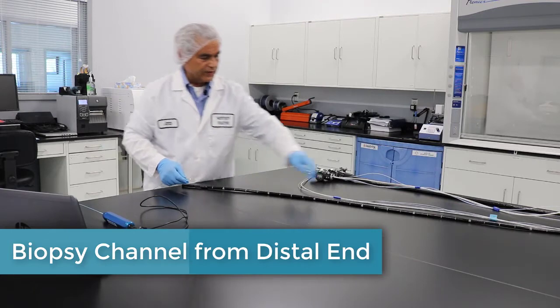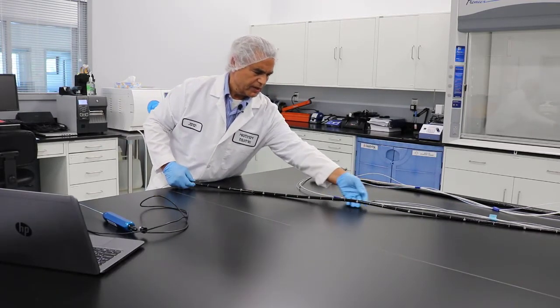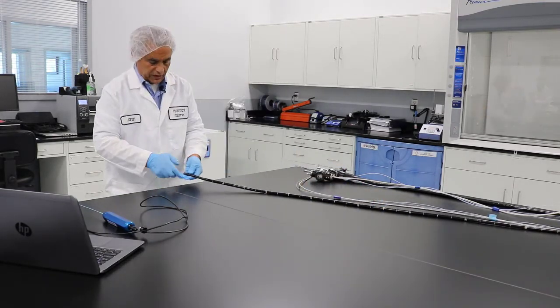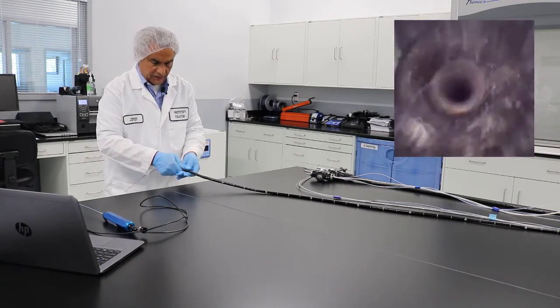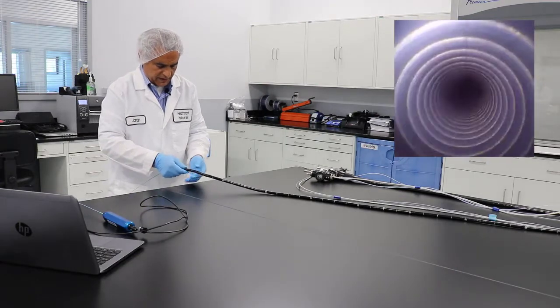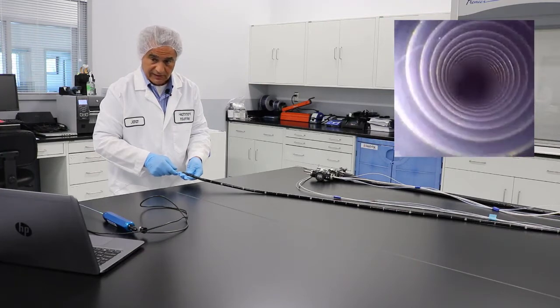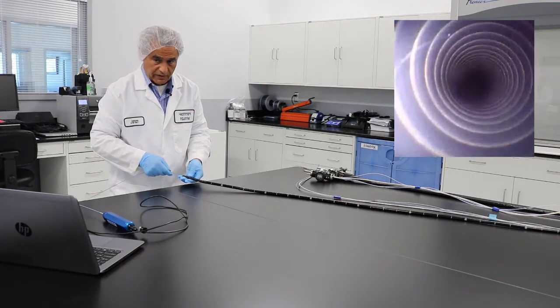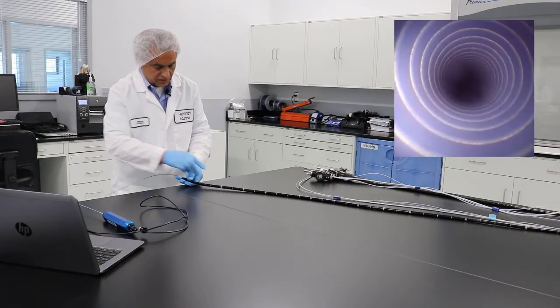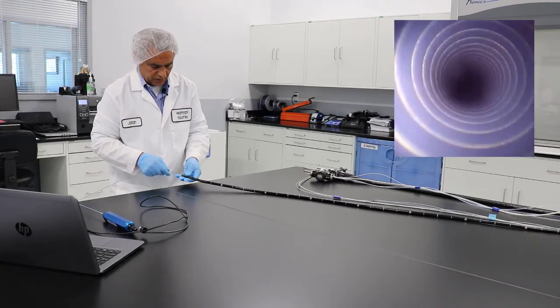From the other end, we came right about here. As you see on the scope, you have markings at 60, 70, or so — we were probably about that point. What we will do: from the distal end we slowly advance. At this area you have the bending section, and you want to make sure that you don't have any damage or tears at this end. Advance at a really steady pace. The markings on the scope are about 10 centimeters apart.